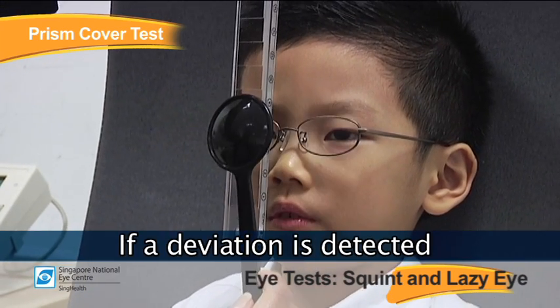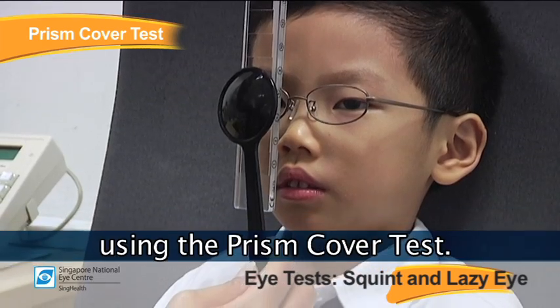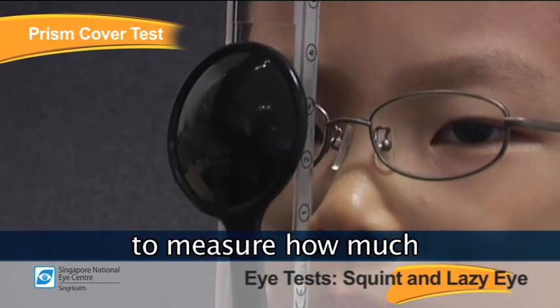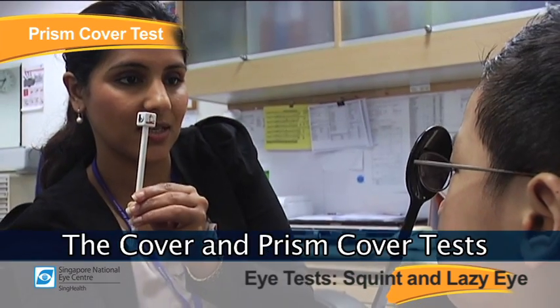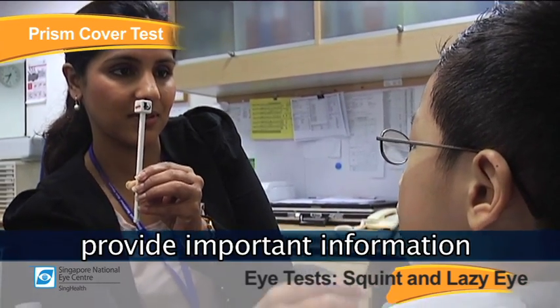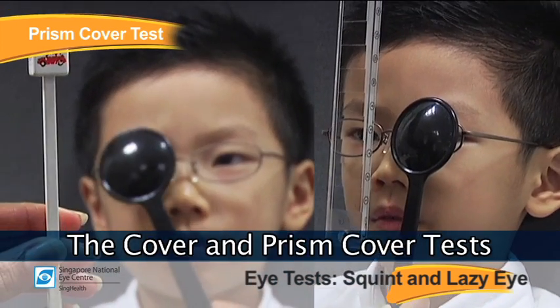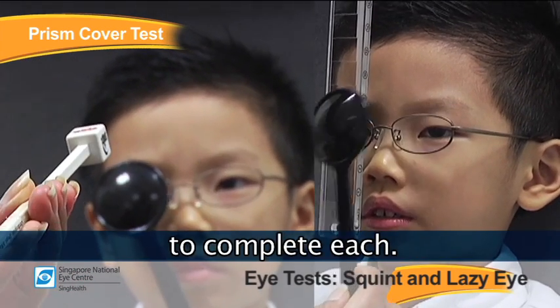If a deviation is detected on the cover test, it can be measured using the prism cover test. This involves the use of prisms to measure how much the eye is turning. The cover and prism cover test provide important information about the type and extent of the squint, and usually take about 10 minutes to complete respectively.